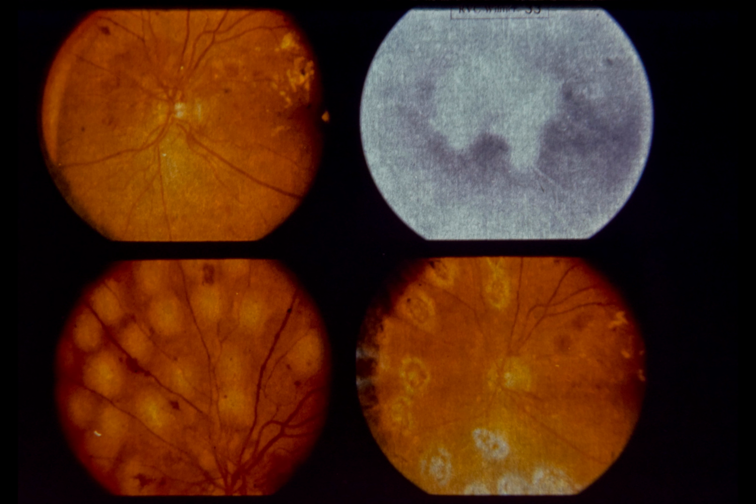Upper right, note marked dye leakage from disc vessels 1 1/2 minutes after injection. Lower left, note scatter pattern of xenon arc photocoagulation. Multiple 4 1/2 degree lesions were scattered throughout the posterior pole, extending out to the equator. No treatment was applied directly over the disc neovascularization.